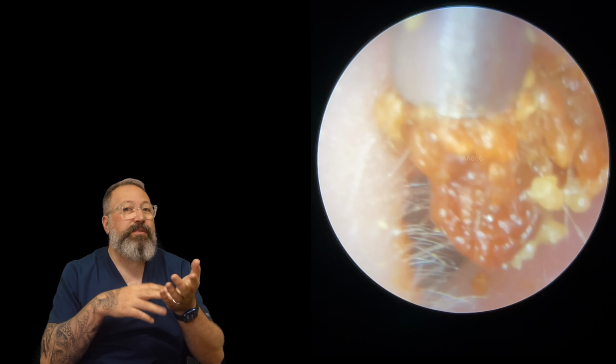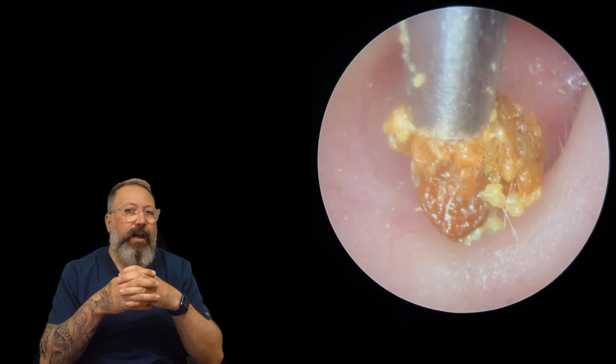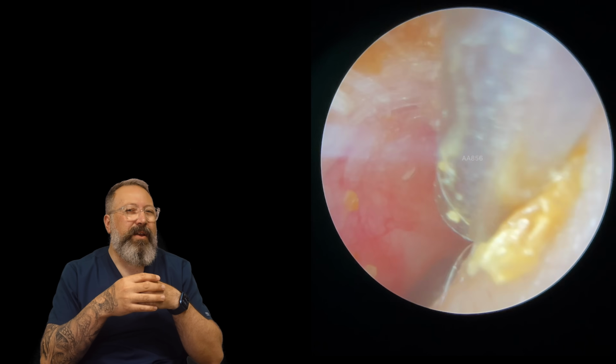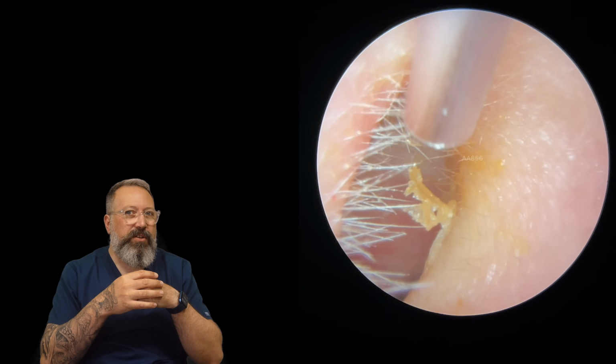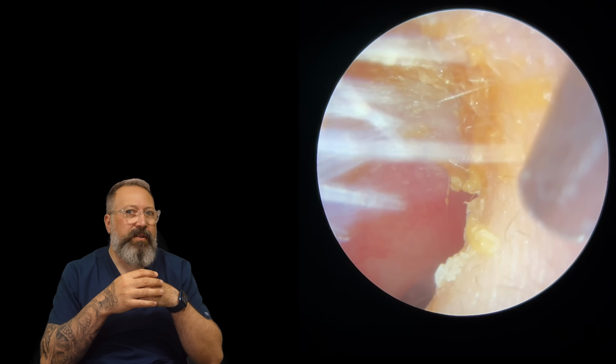This patient actually came to see us about 2 or 3 years ago. We cleared them out then, and they've come in now, I think it's 3 years later. So I've recommended that they come in a little bit more often. But you can see how all that was bunched in the ear canal there. So we're just going to do a little tiny bit of tidying up. Let's get rid of some of these pieces around the outside edge.